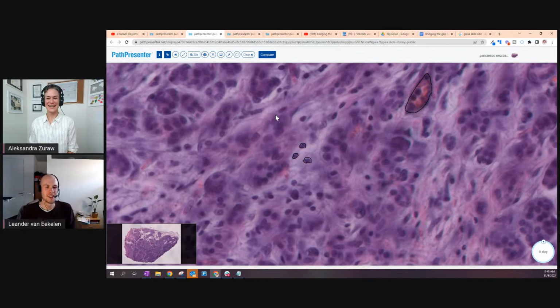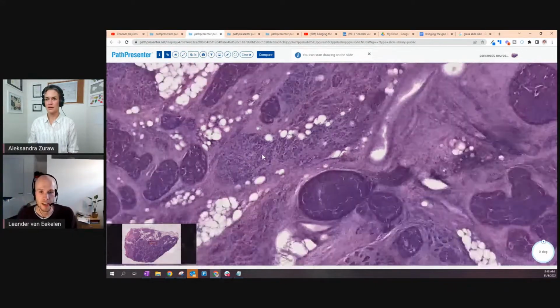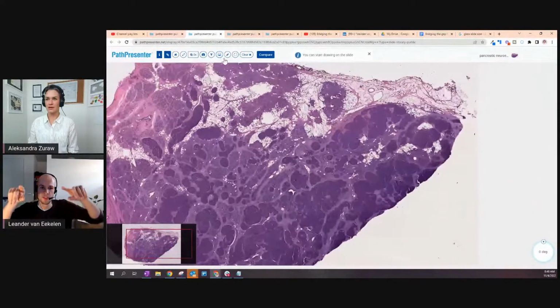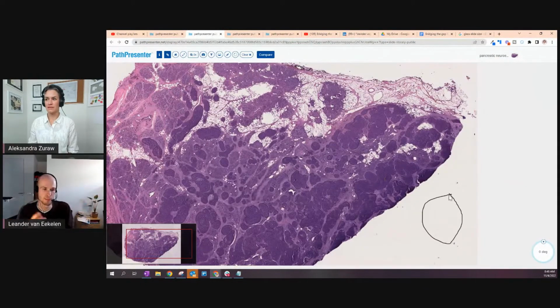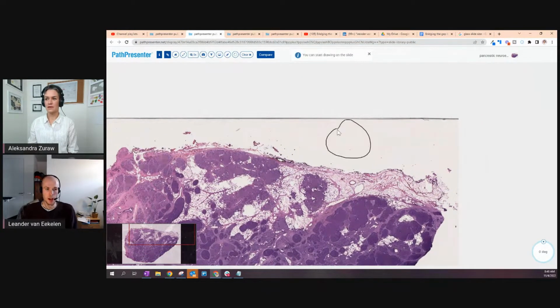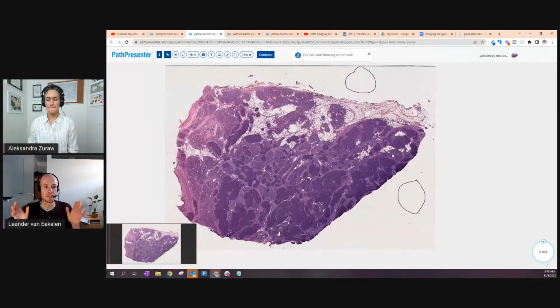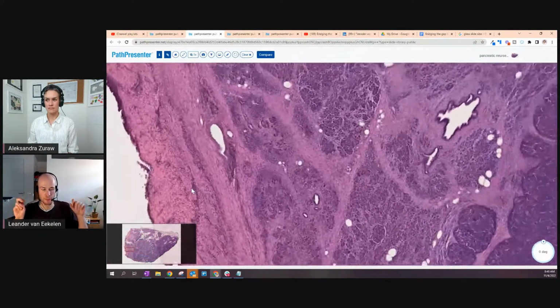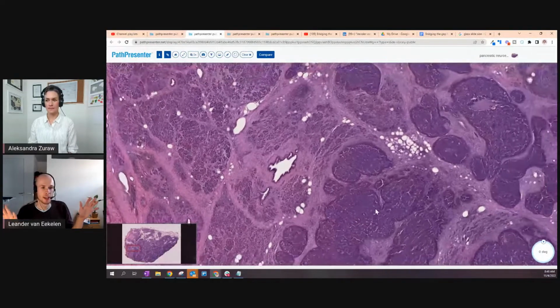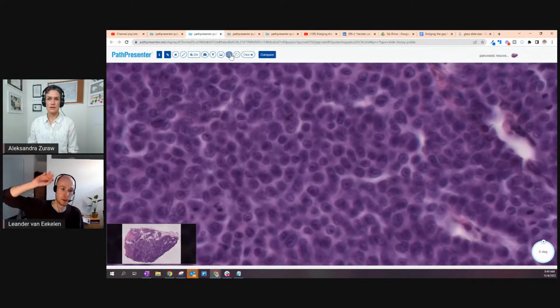But a good example of stuff would be the background around this particular section. If you zoom all the way out to 1x, then a good example of stuff would be the background of this. Yeah, exactly. That's stuff, because it's not a countable object. Basically, with semantic segmentation, you treat everything as being stuff. I don't make any distinction between objects. I just say this pixel belongs to stuff, cell type A or cell type B.